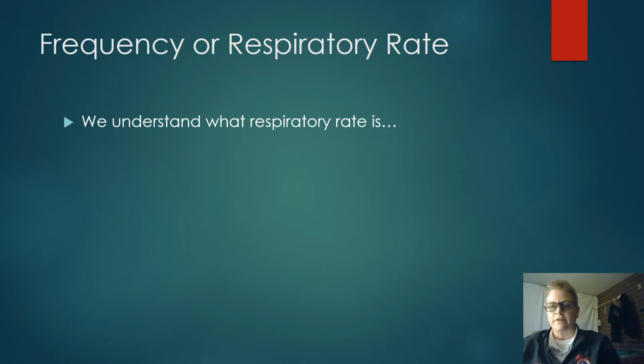They were causing ventilator lung injury. They were causing that ARDS. So those studies showed us that we need to use strategies that protect our lungs. And a lower tidal volume and a higher respiratory rate is going to assist that and help that.